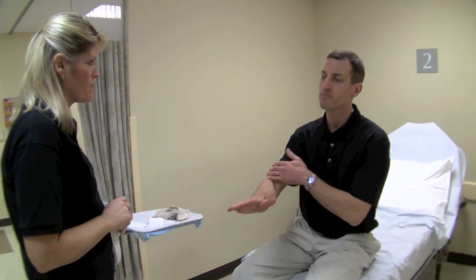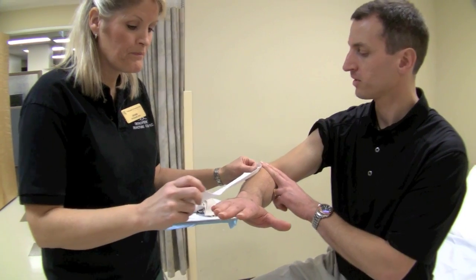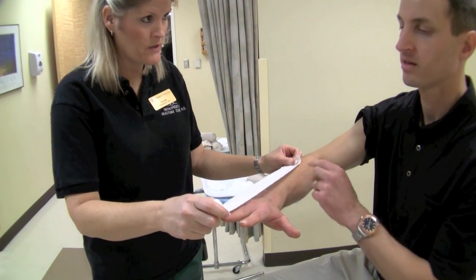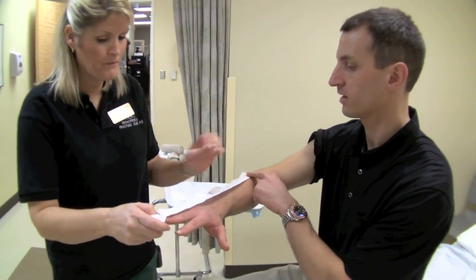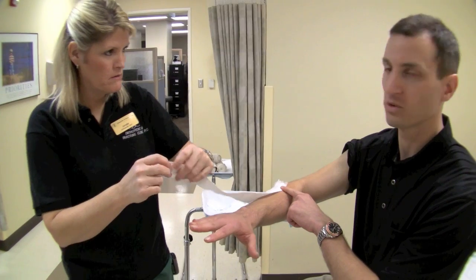First thing, let's measure how long we want our splint. Two finger widths below the antecubital fossa, going all the way to the very tip of the fingers. There is our measurement right there — I go a little bit longer. You can use a ruler or a tape measure.